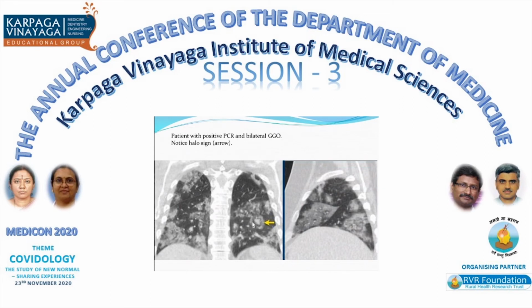So this is the hypodense area, the line which you see is the hypoperfused area, and then luxury perfusion sets in, so there is hyperperfusion. This actually causes a halo, or a reverse halo, and this causes the ground glass changes. So it's not the direct infection. Initially they thought it was direct infection, but later they realized that it is the hypoperfusion and luxury perfusion which are causing these lung changes.